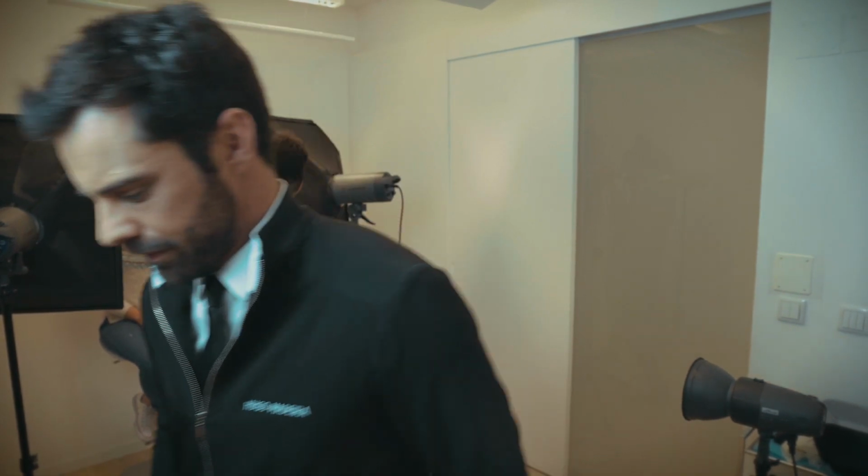The midline, smile curve, and height are factors that guide the evaluation and design of a smile. Although we know the proportion of teeth, it's not always easy to capture the ideal photo. So, first of all, let's start by doing our photo protocol. It's very important to make our photographic protocol in the first appointment so we can register the initial situation and to make possible the digital smile design.